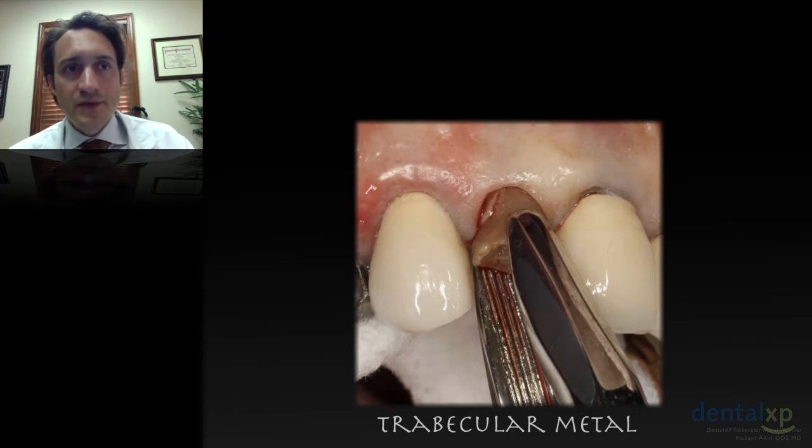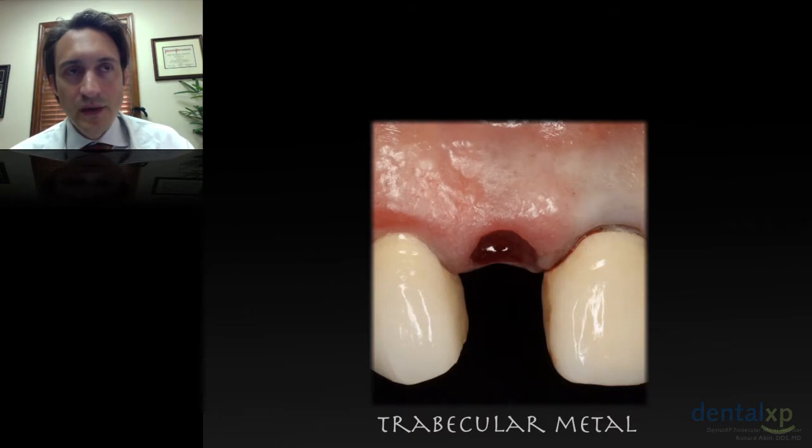These forceps are really my go-to. I have some other types of forceps that I use, but these are ones that I've customized, and I will sharpen them. I'll just use a tapered Fisher burr with loupes under magnification, and make sure they're nice and sharp. That way they can slide down without impinging on the buccal plate, and I have very good grip with these. And using a rotational movement, we can get the tooth out while minimally disturbing the gingival anatomy in the area and any of the bone.